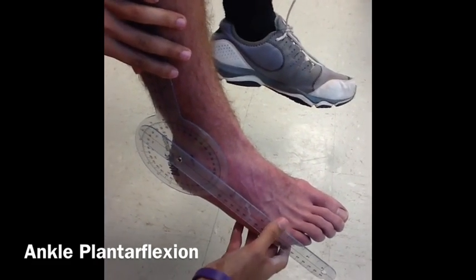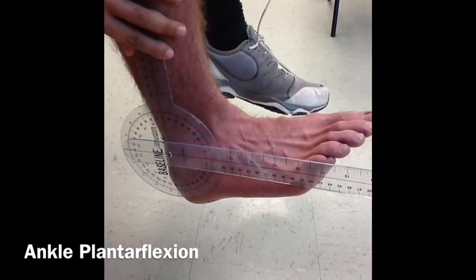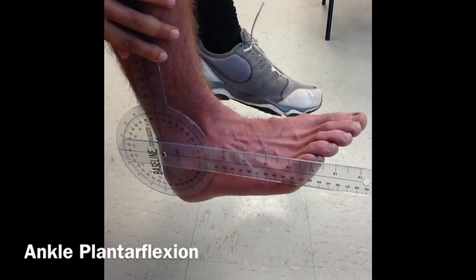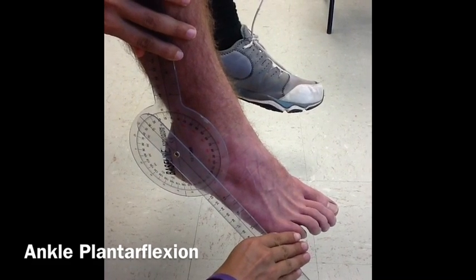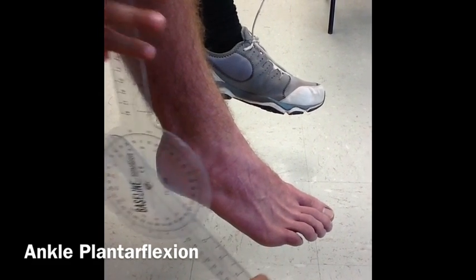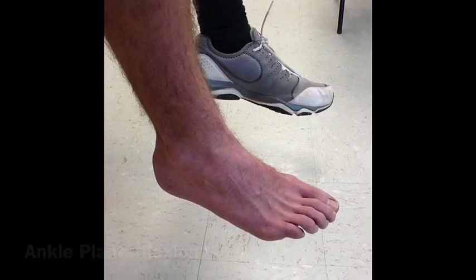Then, bring the patient up to 90 degrees. From there, we will have them actively plantar flex and instruct them to point their feet towards the ground. Then measure their range of motion. The result is 55 degrees, which is normal range of motion for plantarflexion, as the normal range is 40 to 60 degrees.